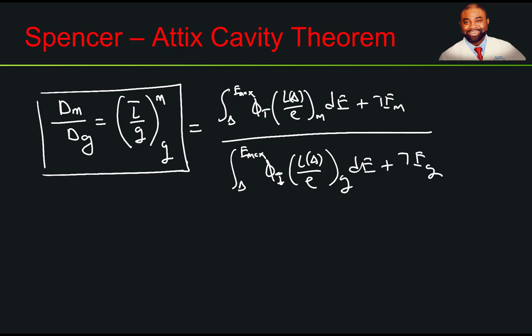So the remarkable thing that you need to take note about this formulation is that this term, Tm, accounts for 5 to 10% of the dose due to the track ends.